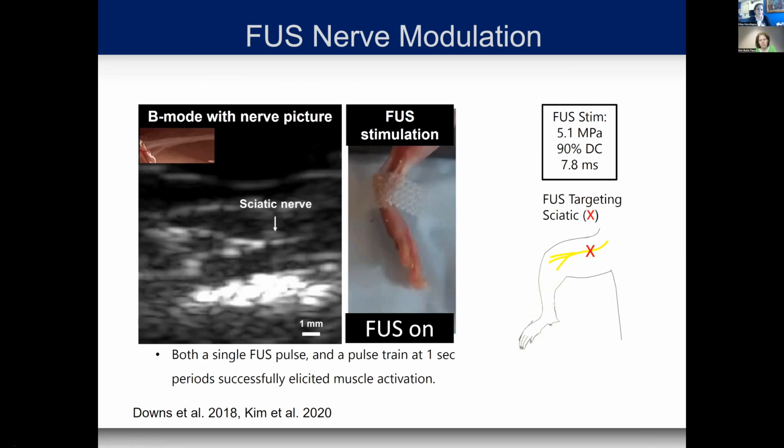basically neuroscientists that were interested in the nerves. Ellen Lumpkin is now at Berkeley, and she enlightened us many times because we had no clue even where some of the nerves are in mice. The good news is that we used ultrasound imaging to locate nerves, and that's used a lot in the clinic, especially for anesthesia induction. Typically for anything orthopedic, you will want the nerve to be anesthetized, and they use ultrasound to guide the needle and find the nerve. So we became experts in nerve imaging.